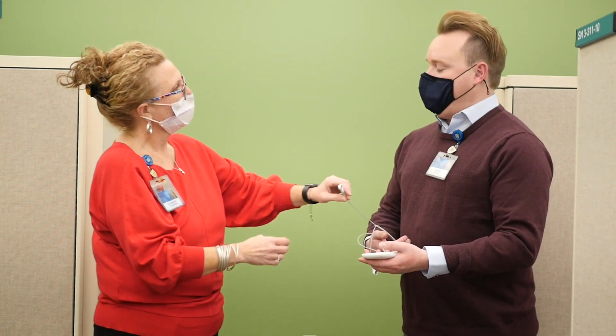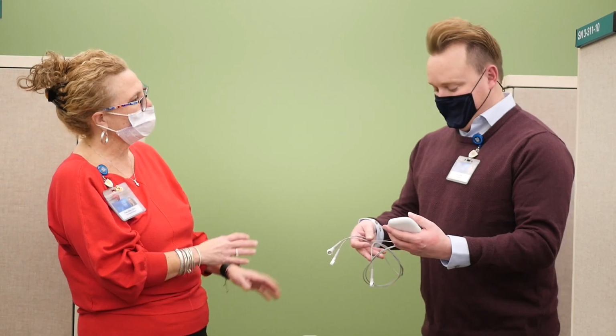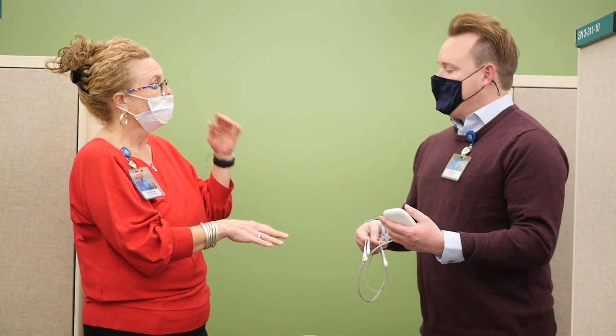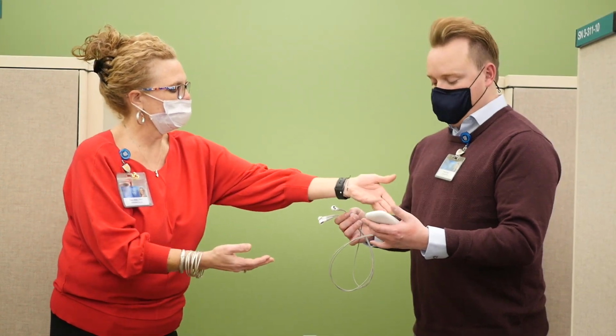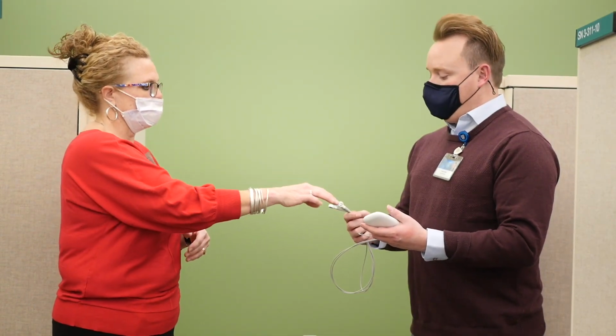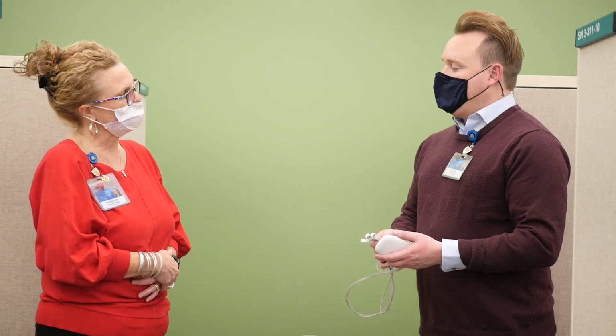It's like I'm a DVD player. You are like a DVD player, exactly. And they get to leave these stickers on their chest when they bathe. They just pull this off. Okay. So they never have to detach anything, really, other than they change a battery in the back once a day. That's it. Okay.